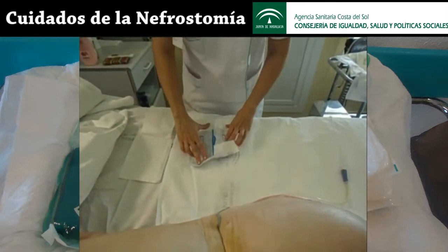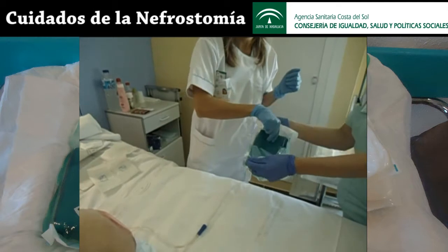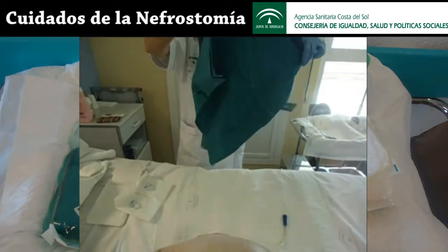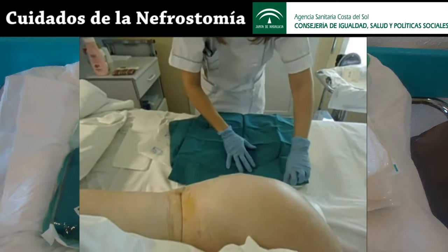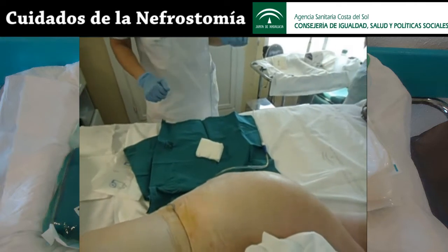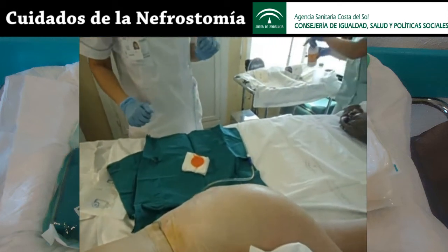First of all, put a new pair of sterile gloves on. Place the green cloth and wet some gauze pads with chlorhexidine antiseptic solution. Wet some new gauze pads with saline solution.